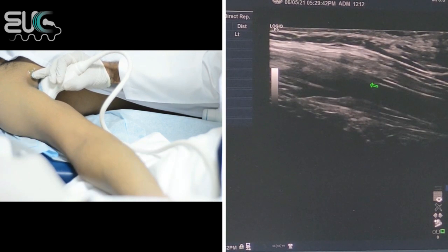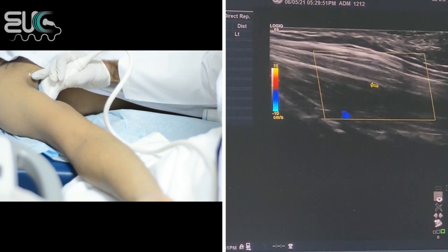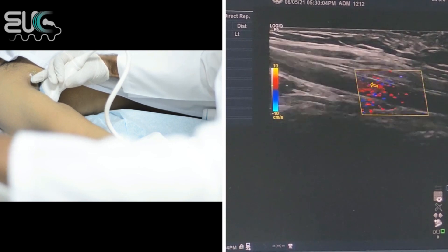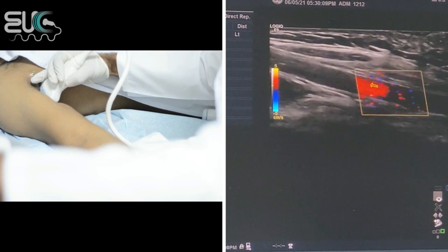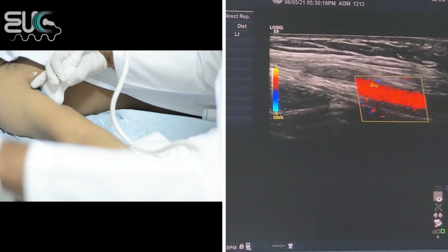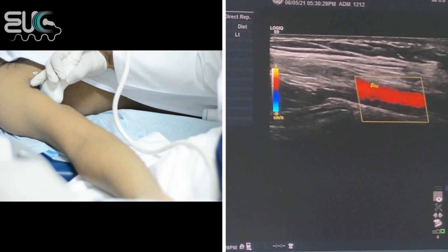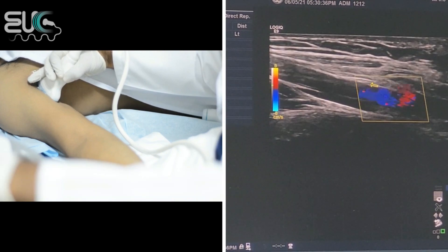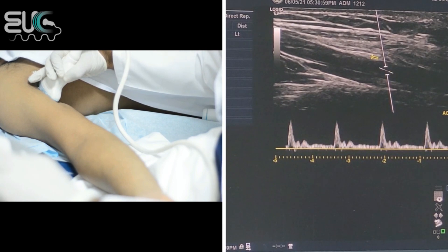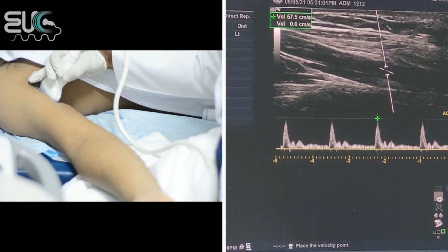We have a nice lumen, a nice wall. Then I will add the color box. I will increase the gain and reduce the scale until we have a good filling. I will reduce the gain and increase the scale. I think now we have a good laminar flow for the axillary artery. Now I will check the pulse wave. We have a nice triphasic waveform for the right axillary artery with a peak systolic velocity of 57.